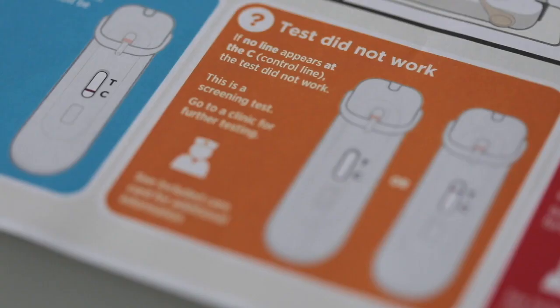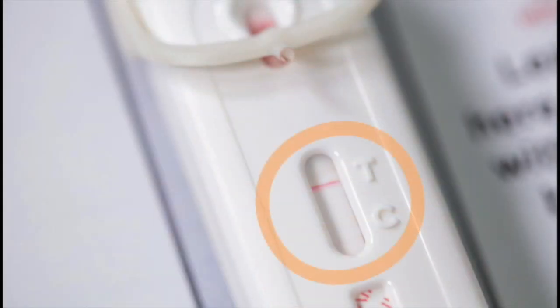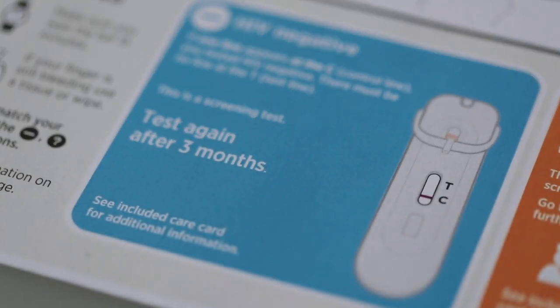Look in the box labelled Test did not work. If no line appears next to the C, then the test is invalid. Even if a line appears next to the T, because this is a screening test, go to a clinic for further testing. Look in the box labelled HIV negative. If a line appears next to the C, but no line appears next to the T, you have tested HIV negative. You should test again in 3 months' time.